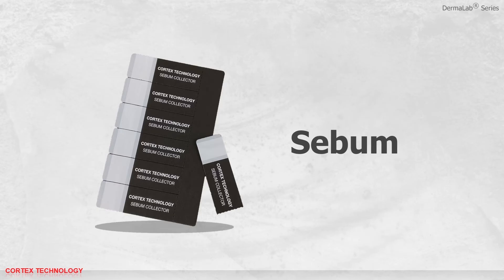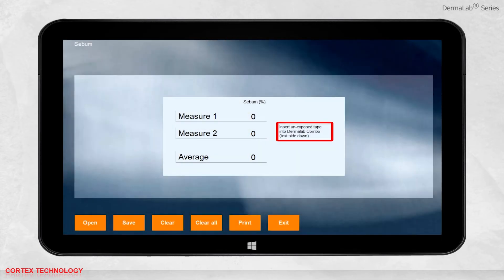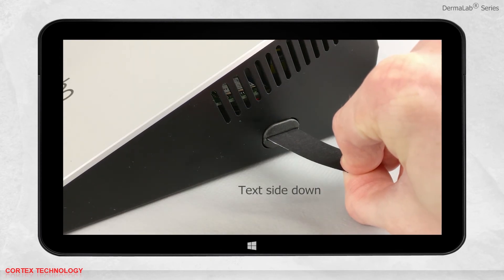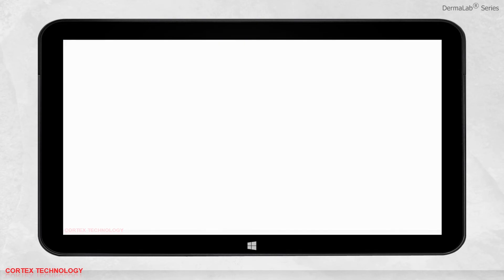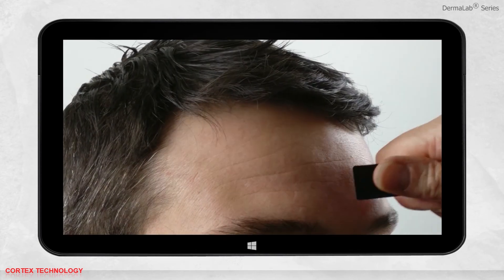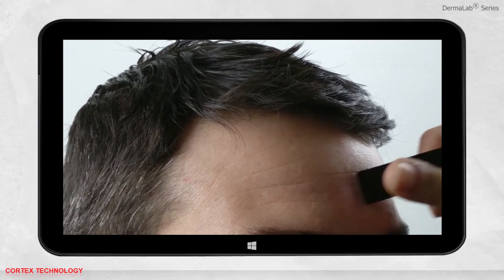Sebum application. Select sebum and follow the instructions in the interface. Insert an unexposed tape into the Dermalab Combo with the text side down. The interface will now tell you to apply the tape to the skin. The best spot to measure is in the T-zone. Place the tape on the desired location, then apply firm and uniform pressure over the entire collecting area for the best result.